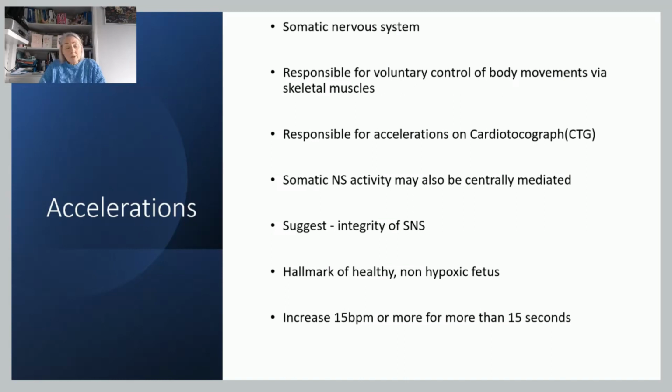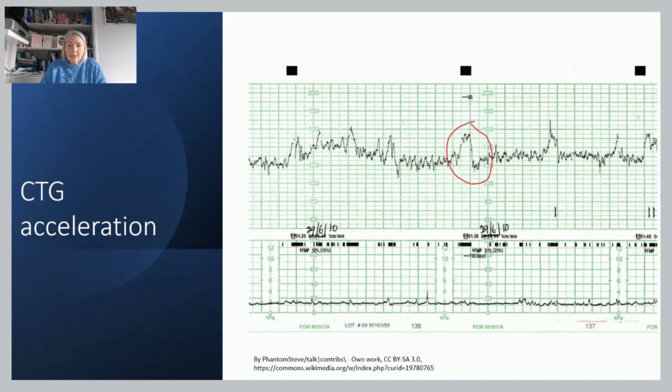Okay, and the definition of an acceleration really is an increase of 15 beats or more for more than 15 seconds. And if we look here, we can see this CTG has got a number of accelerations. So I've just circled one of them, but there's one here, here, here, here, here, and just as the CTG is going off as well.